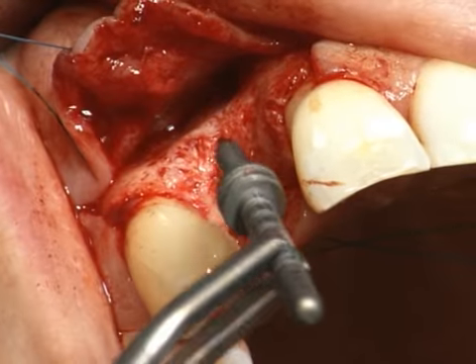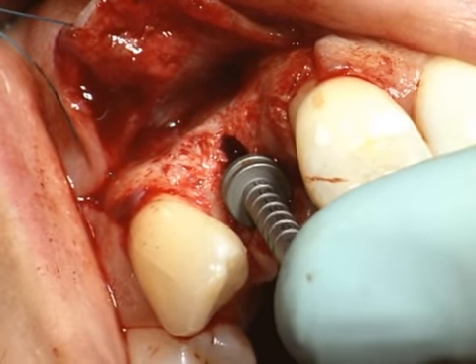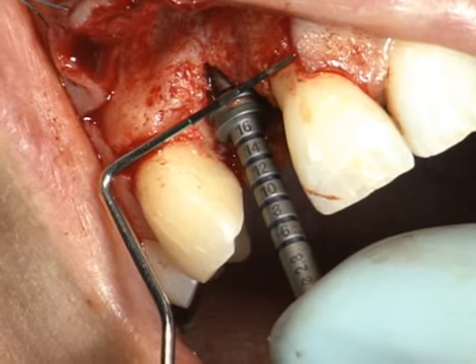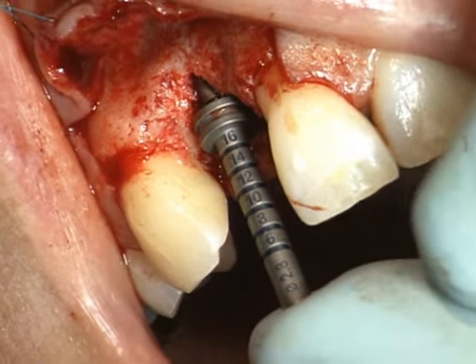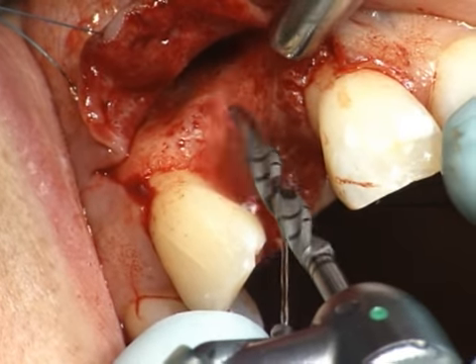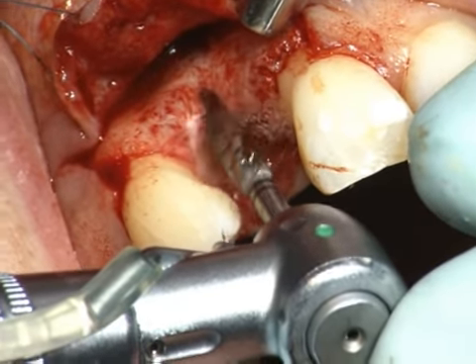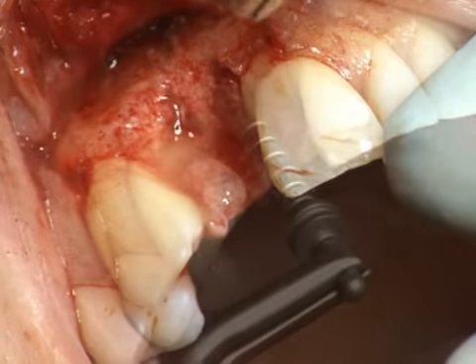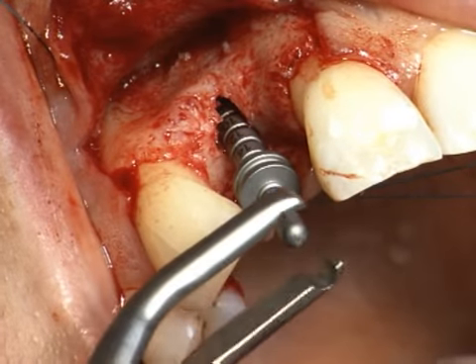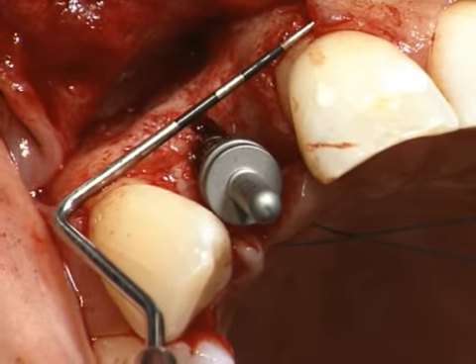The orofacial implant position is now checked with a 2.2 mm diameter depth gauge with attached distance indicator ring. The periphery of the 4.8 mm ring should be placed against the adjacent teeth slightly palatal or lingual to the periodontal probe. The implant bed is now widened with the second pilot drill, which has a diameter of 2.8 mm at a maximum speed of 600 rpm until the planned depth of insertion is reached. The orofacial position and the depth of drilling are again checked with the depth gauge. The planned position is now optimal.